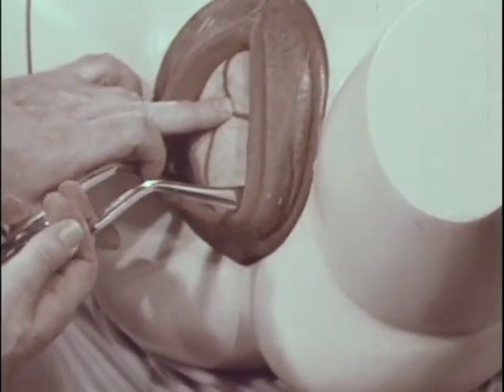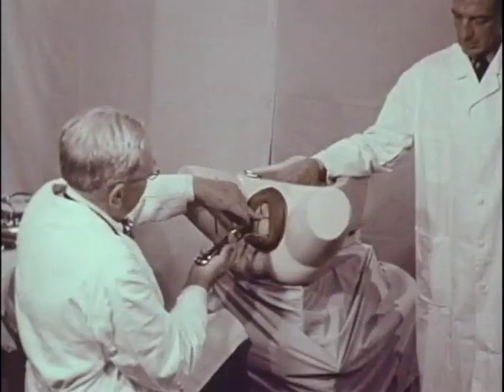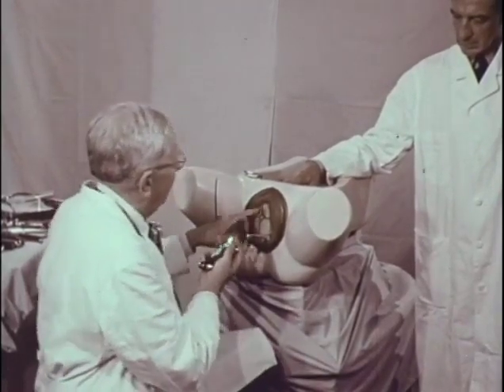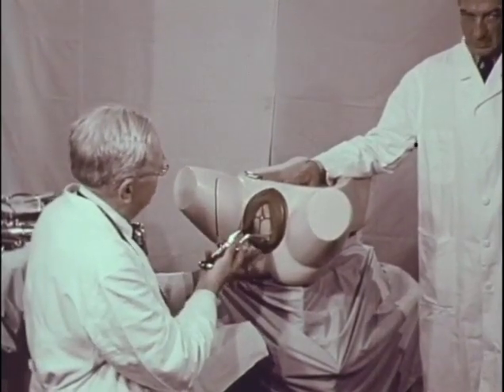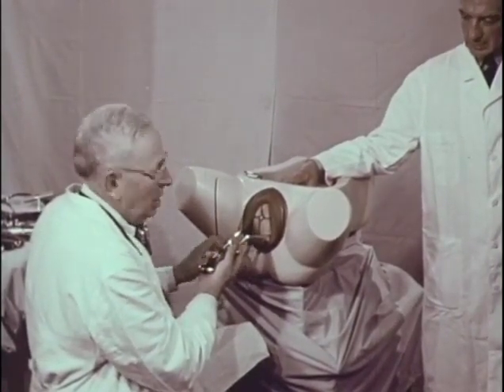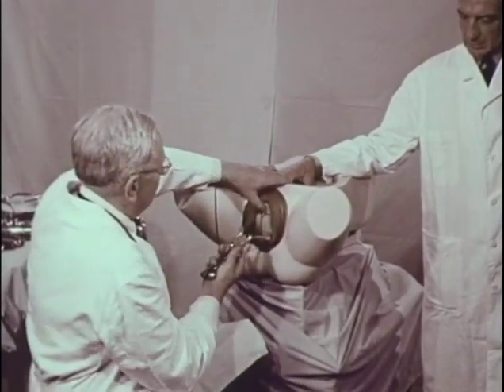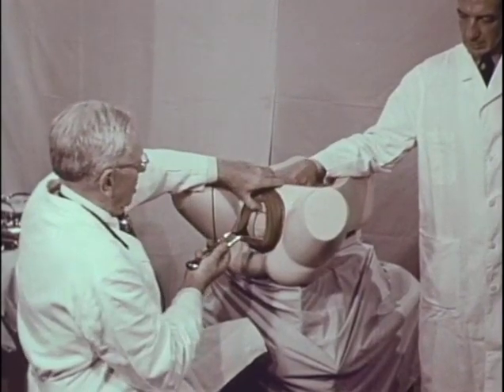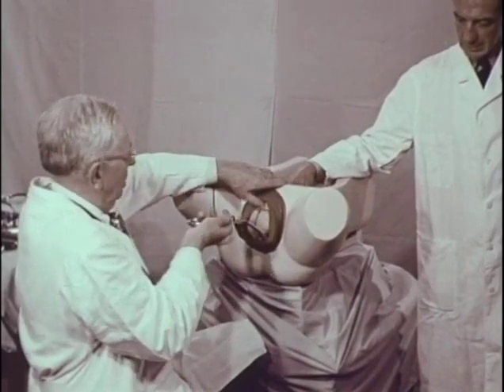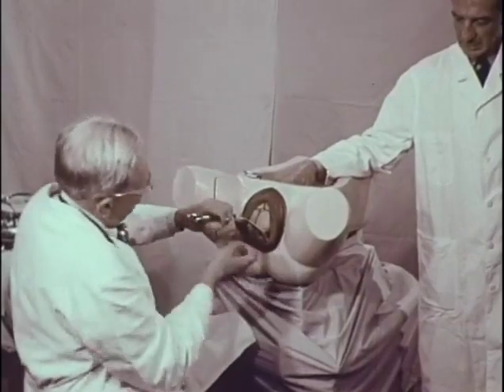The object is to deliver this occiput by flexion. Deep episiotomy is desirable, and unless one has an anthropoid type of pelvis, one with a long anterior-posterior diameter, it would seem advisable to do a medial lateral episiotomy in order to protect the rectal sphincter. Completing flexion, delivering the occiput by flexion over the perineum.